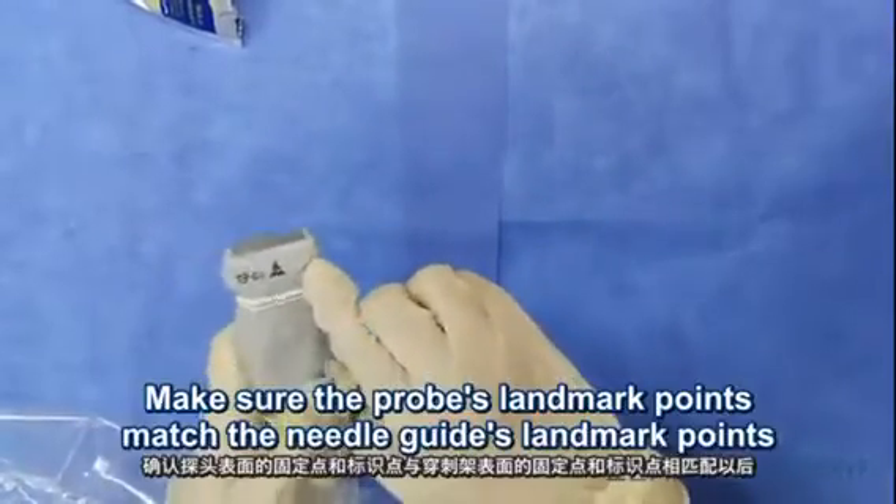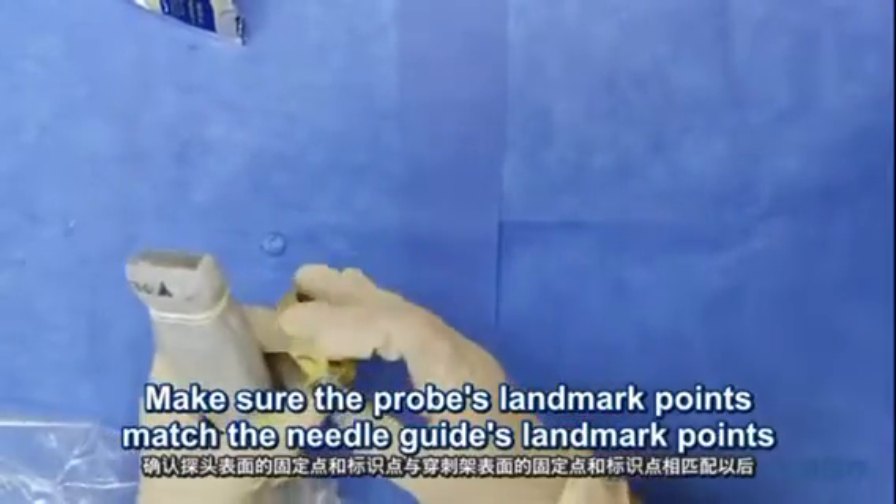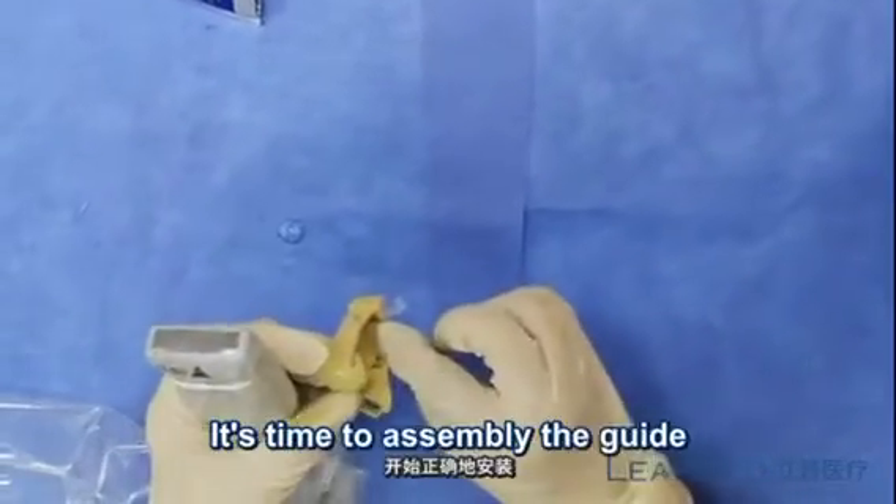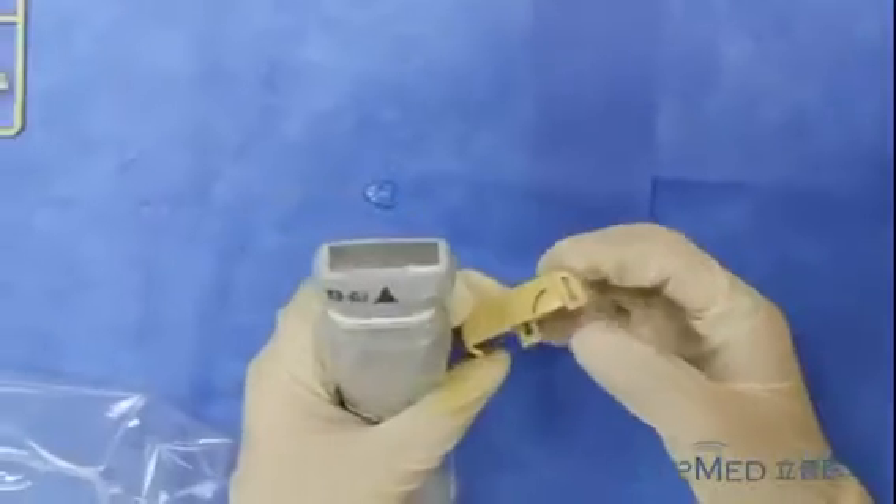After installing the probe cover, make sure the probe's landmark points match the needle guide's landmark points. It's time to assemble the guide.